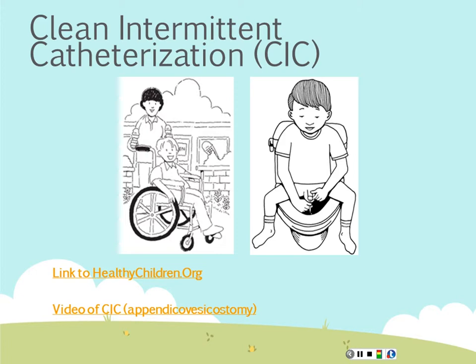The nice thing about that is that they don't have to have their pants off to cath urethrally. If they're in a wheelchair, they can cath from a wheelchair. They don't have to be transported. They can do it themselves, especially if they have musculoskeletal disorders where their arms are shorter or they're not able to move and reach as well. That's the nice thing about the appendicovesicostomy.